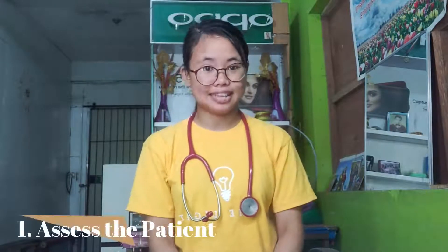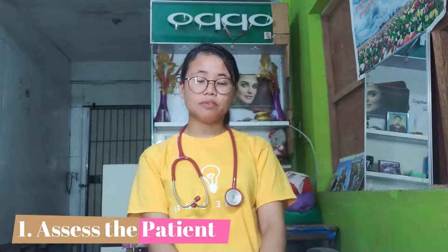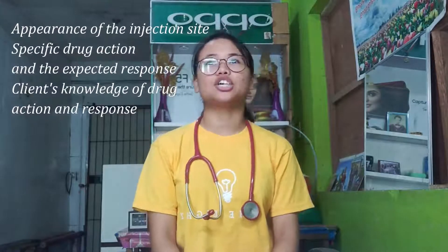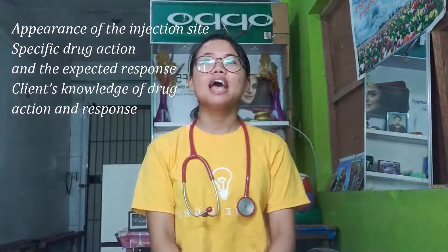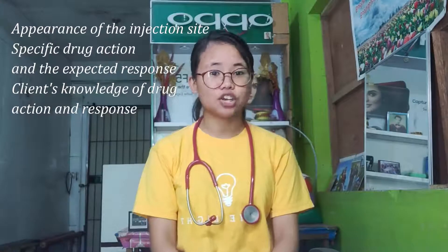In administering an intradermal injection for skin tests, first you need to assess the patient. You need to look for the appearance of the injection site, the specific drug action and expected response, and lastly, the client's knowledge of drug action and response.